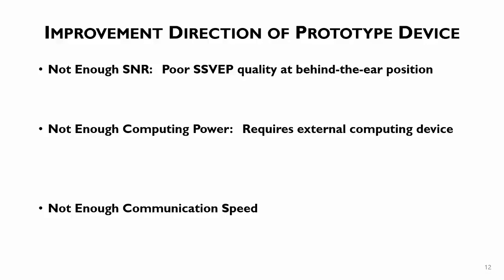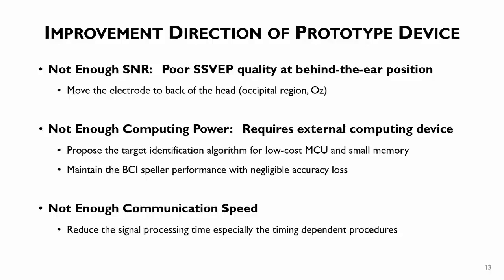These 3 points can be improved by our proposed solution. We moved the electrode to the back of the head, and we proposed a target identification algorithm while maintaining the BCI speller performance. And we reduced the signal processing time, especially the timing-dependent procedures.